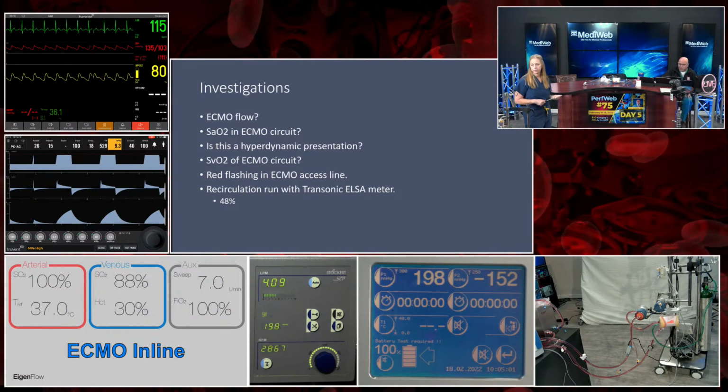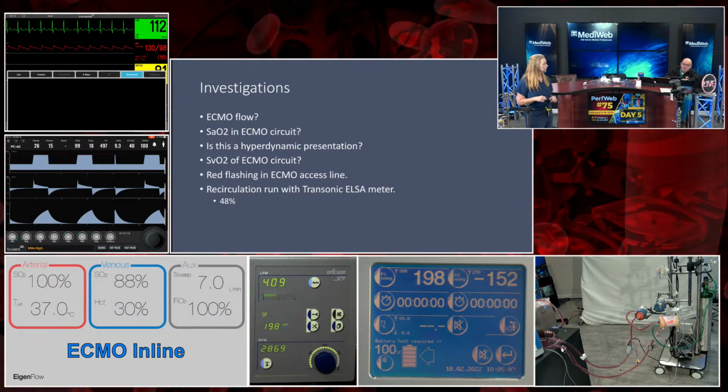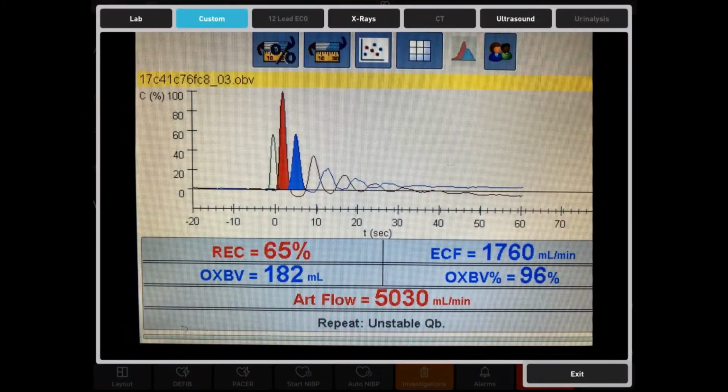And lo and behold, your recirculation is 65%. Look at that. That's a big problem.